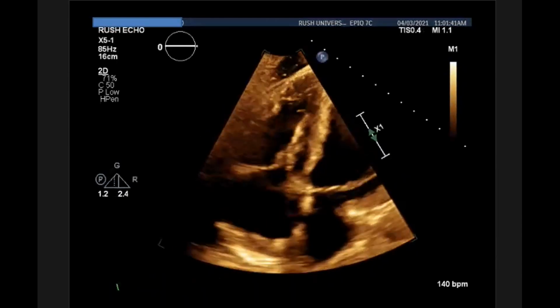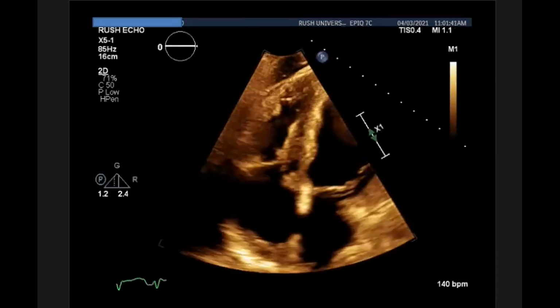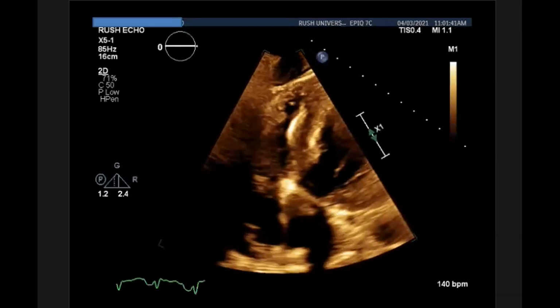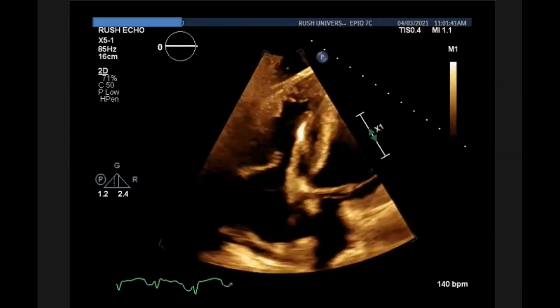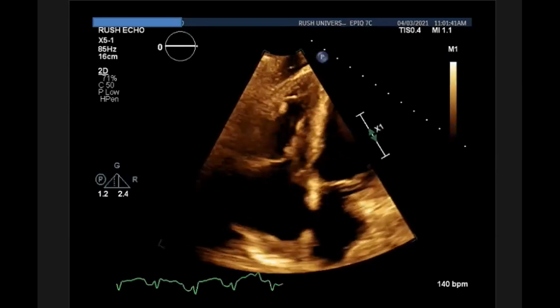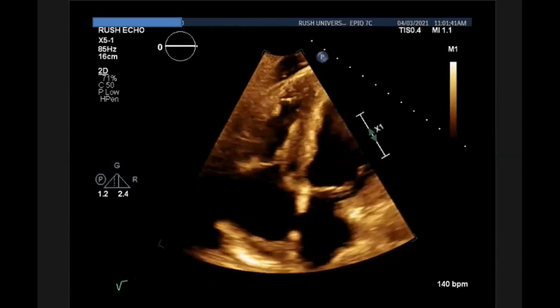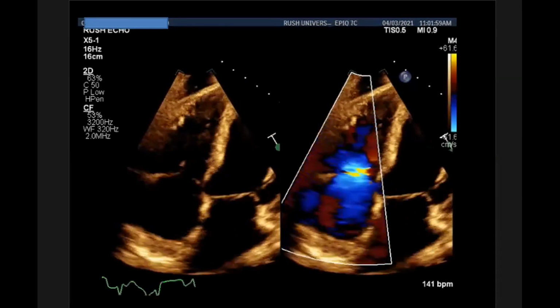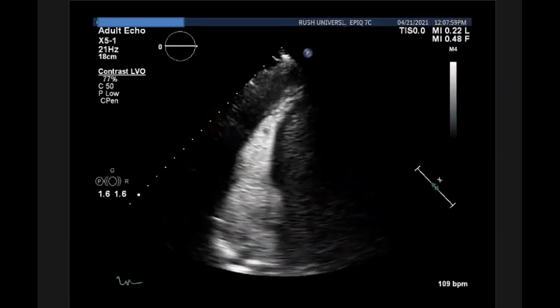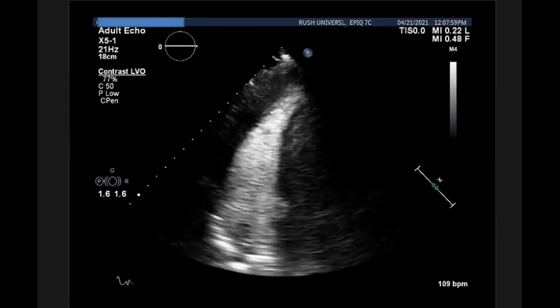Here's the patient 1 day after the LVAD was placed. I brought in just the RV function because putting both the RV and the LV in the same view is quite difficult when you have both chambers dilated and dysfunctional. But you can see here, this patient developed RV dysfunction as well as a pericardial effusion. You can see the TR worsened. And here, after nice careful waiting, this patient did not require RVAD support.